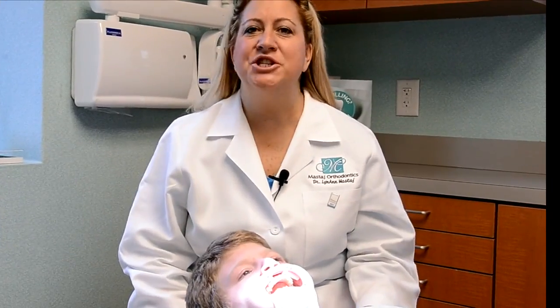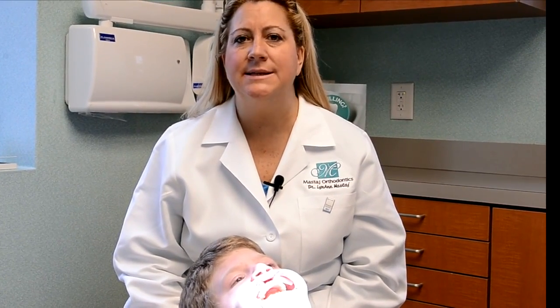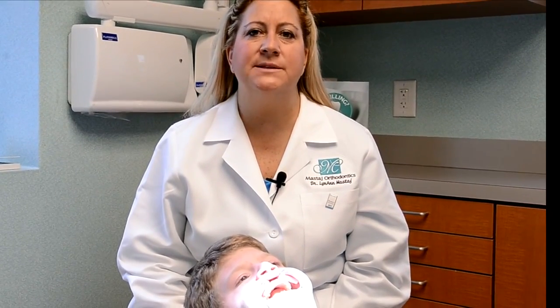Today, I'm actually going to do a demonstration on how easy it is to treat white spots and incipient caries. This is my patient Jason, and today we're going to be doing his incipient caries on teeth 7, 8, and 9, and we're going to be doing some surface white spots.